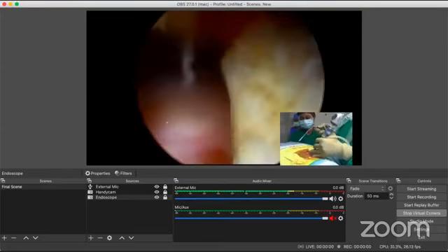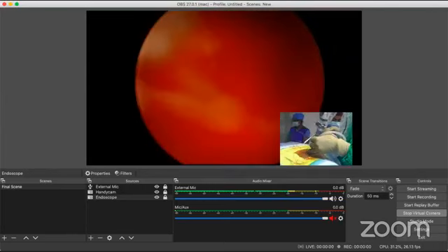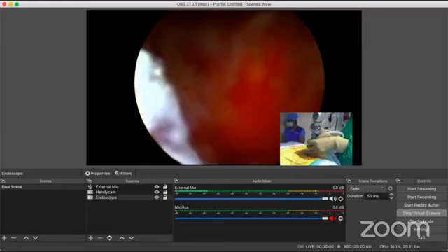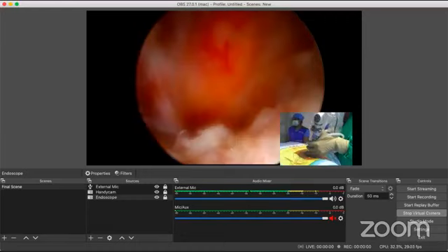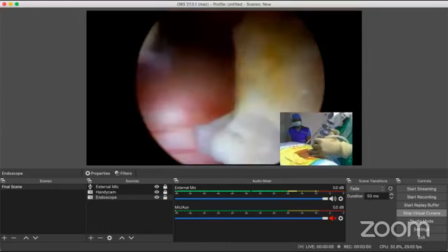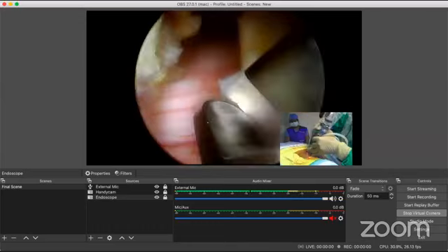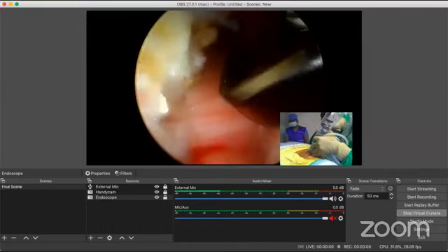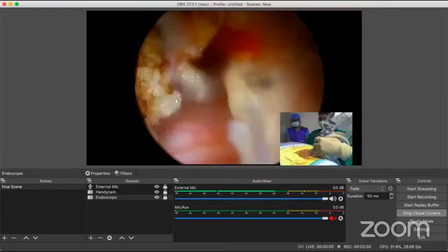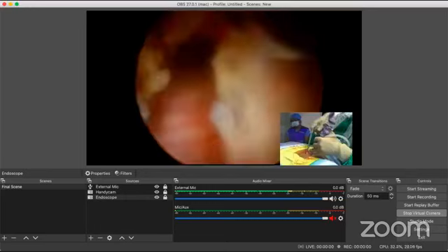You can see the central cord nicely, the entire dural surface, the entire root in its path and glory. I'm sorry, the patient's blood pressure has spiked a bit, so I beg your forgiveness. I can't show you a better and clearer field, but I think this is decent enough. And I think we can call it a day today.